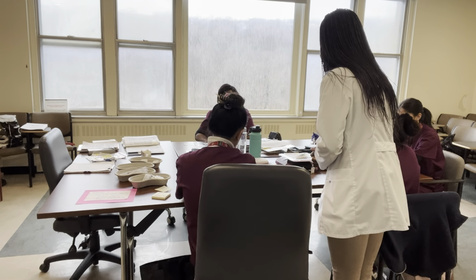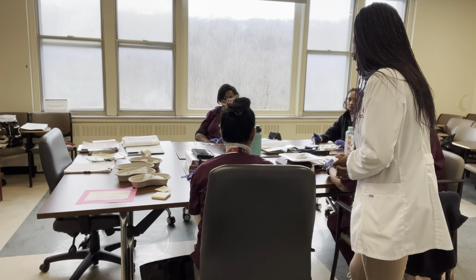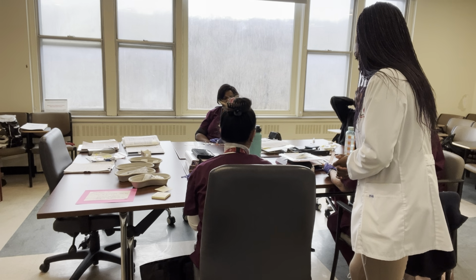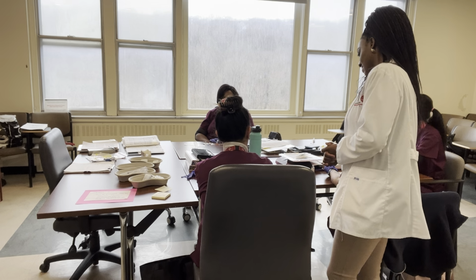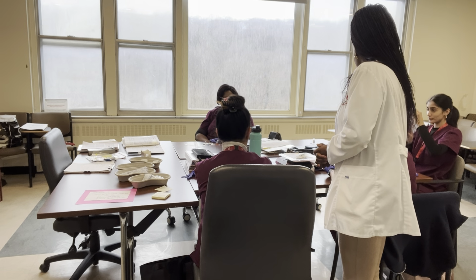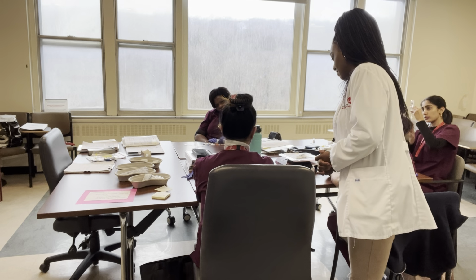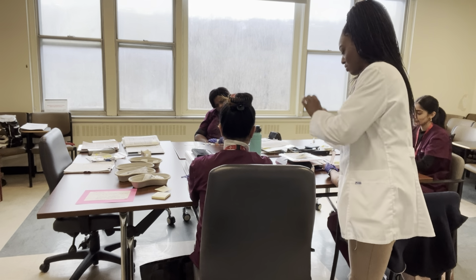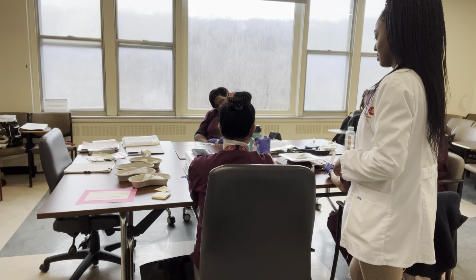Go ahead. Okay, so I'm gonna go to the patient's room, I'm gonna verify the patient's bracelet, check for the sharps, I'm gonna explain to the patient what I'm gonna do. I'm gonna open the site, I'm gonna wipe it, disinfect. Okay, you can help each other. I'm gonna tap it in the air. Hold it. No, hold it up. Yeah. There you go.